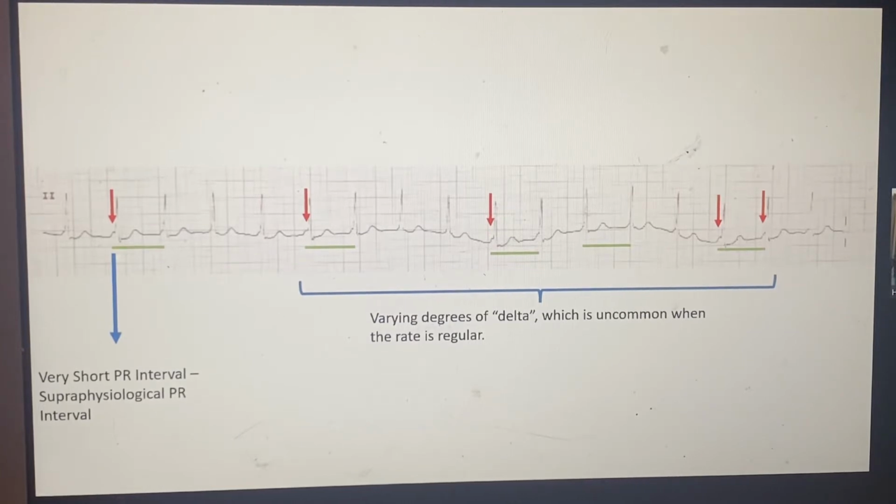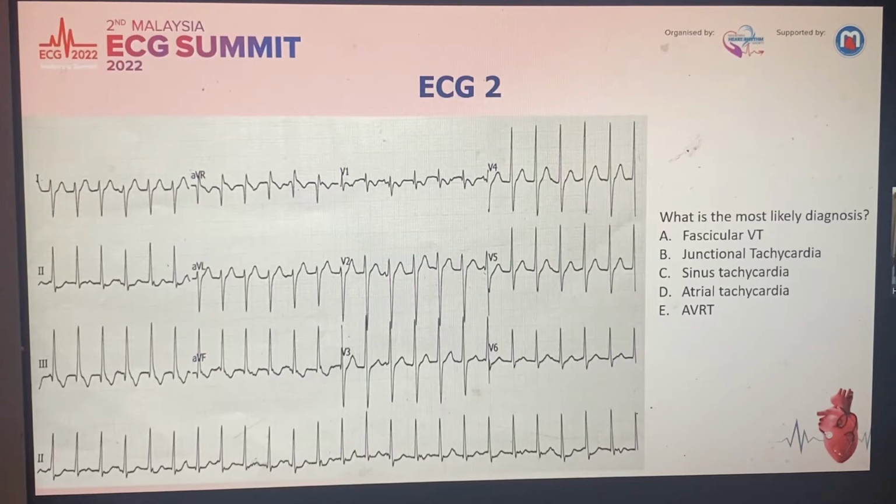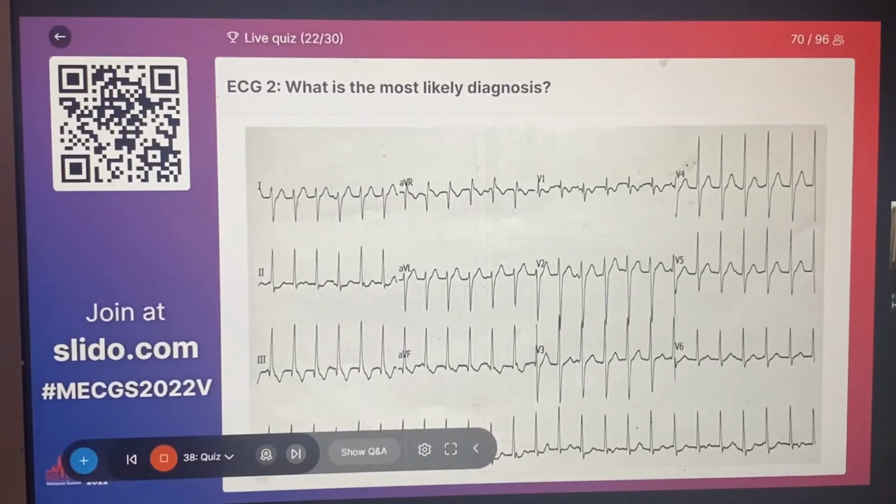Yes. Okay. So now we go to the second ECG. Before we go, let's see how the audience answered.